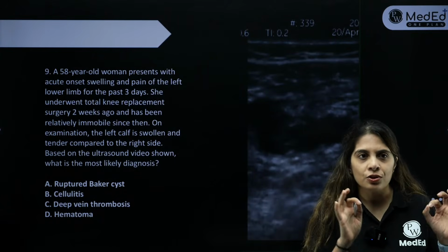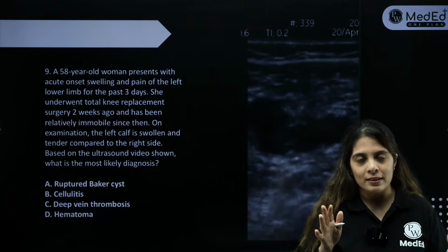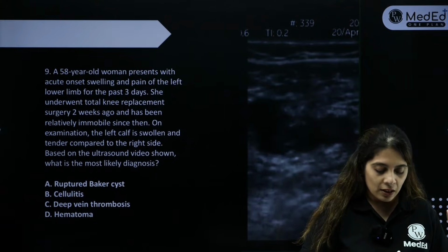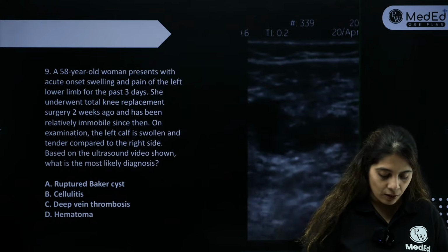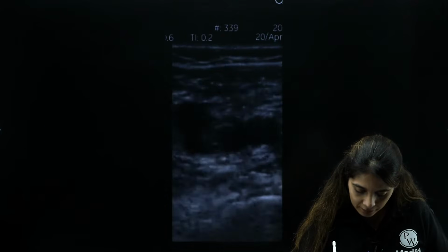So with the clinical question, you know that we are mainly discussing deep vein thrombosis, right? Sometimes they will not give you this clinical question, they will just give you this video of the groin region. So my probe over here is in the groin, and I'm just going to display this video to you, what you are seeing over here.